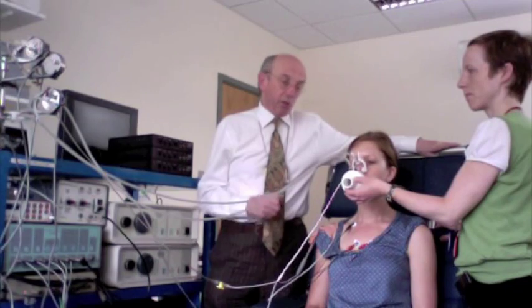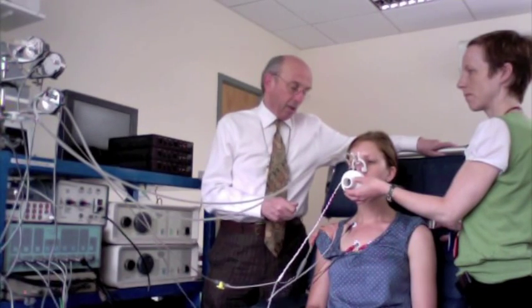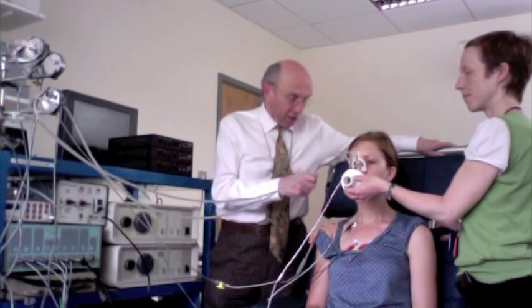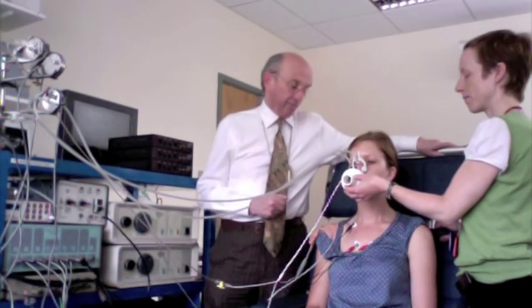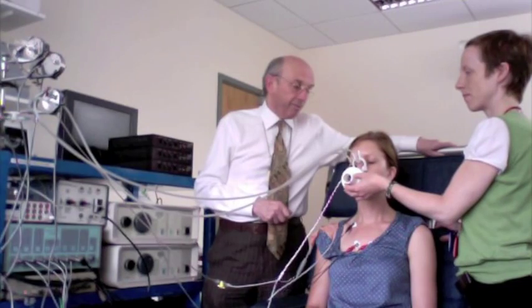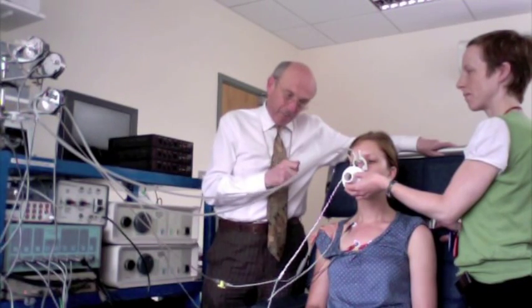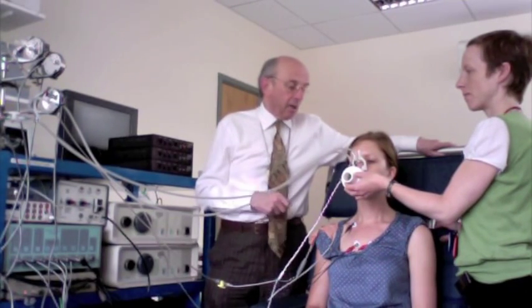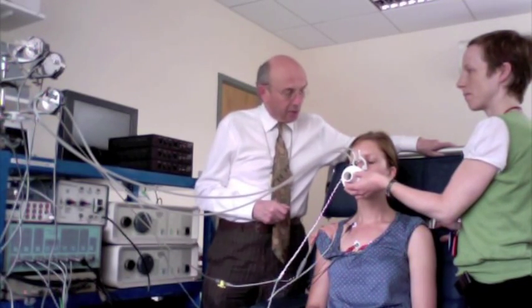We're going to stimulate breathing by entraining carbon dioxide into the system, which will make you breathe more, and we'll see what happens to the drive to these muscles of breathing as breathing increases. That will allow us to calculate the slope of the increased drive, which we think is a very useful thing to document, because in patients with disease we anticipate the slope will be much steeper, reflecting the fact that they have much less reserve capacity in their system.